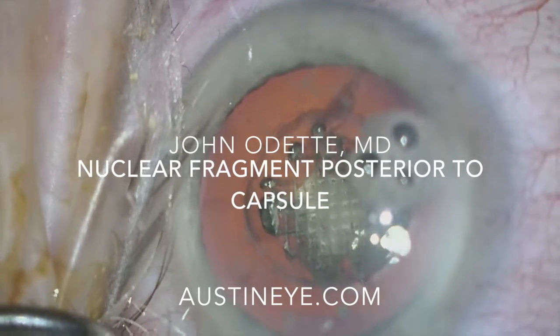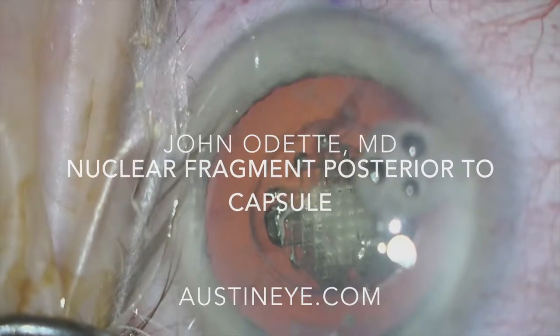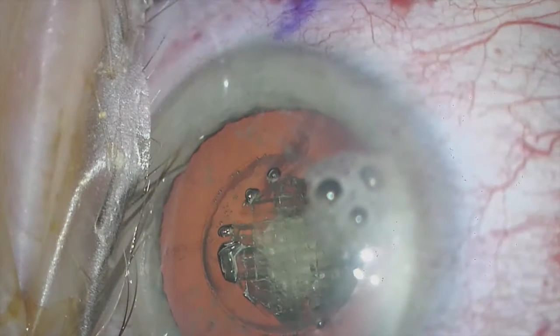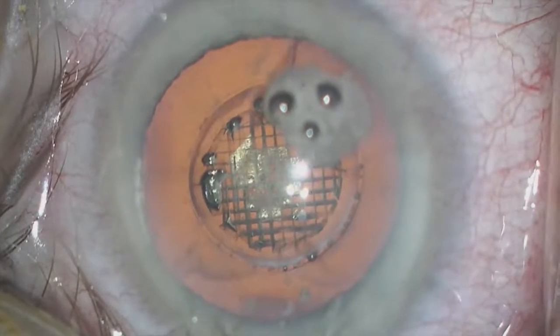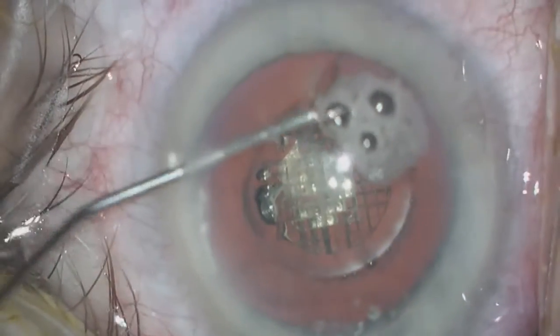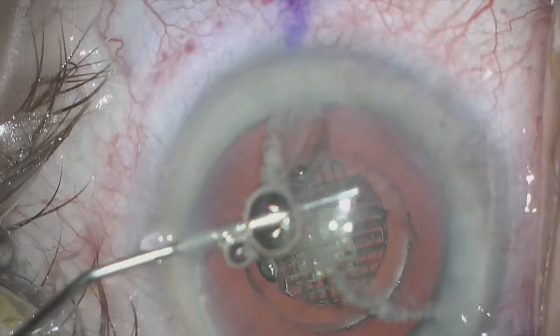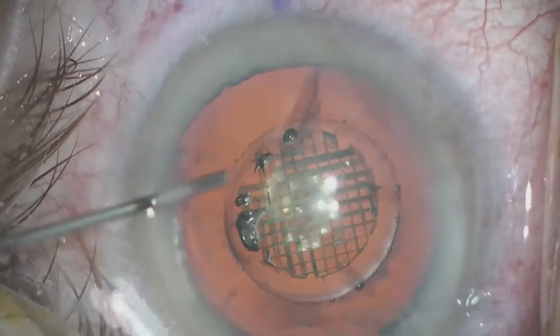In this case, I will be showing you a small fragment from a femtosecond cataract surgery that has migrated posterior to the capsule. As you can see, this lens has already been fragmented and the anterior capsulotomy made by the LensX femtosecond laser. We inject a significant amount of viscoelastic into the anterior chamber to protect the endothelium.